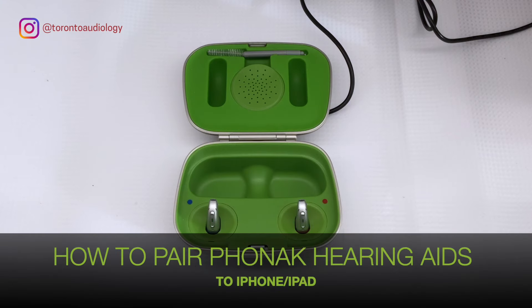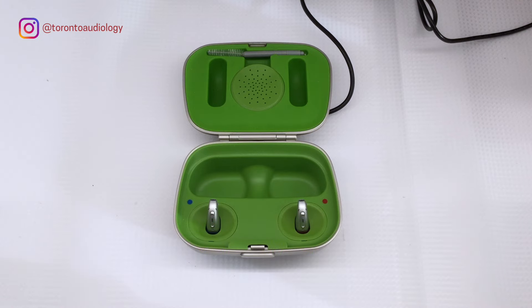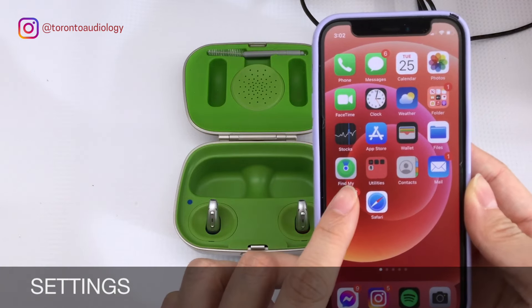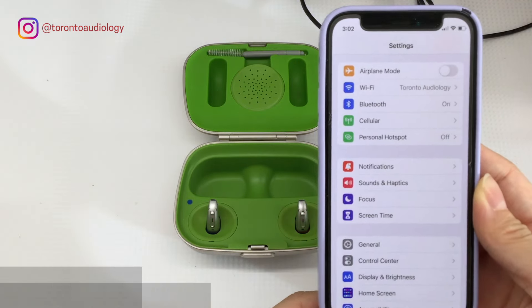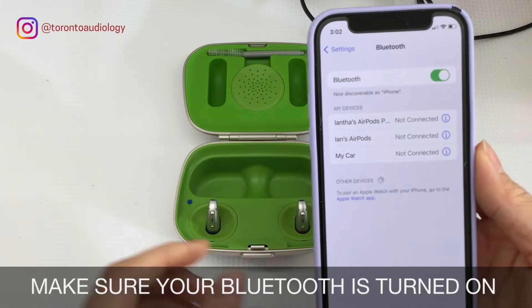Today we're going to show you how to pair your Phonak hearing aids to your Apple devices, such as your iPhone or iPad. First, click on Settings, then click on Bluetooth. If your Bluetooth is turned off, now's the time to turn it on.